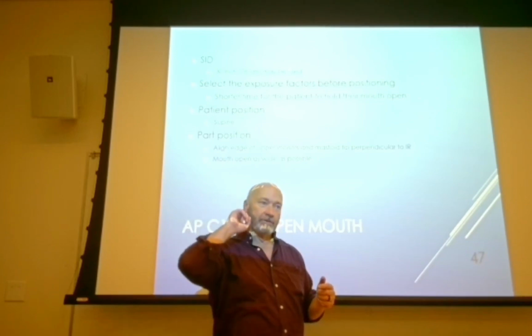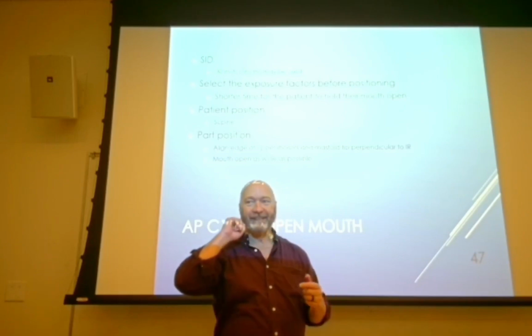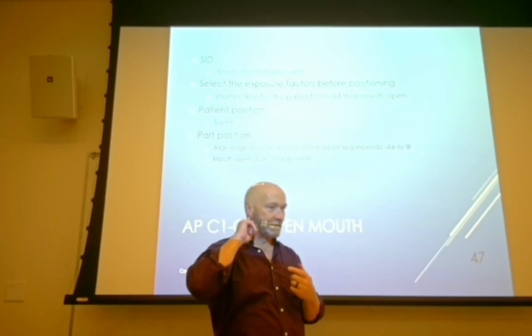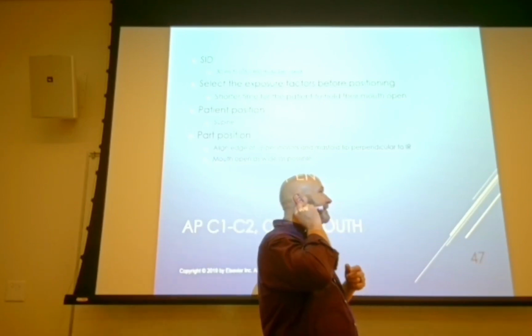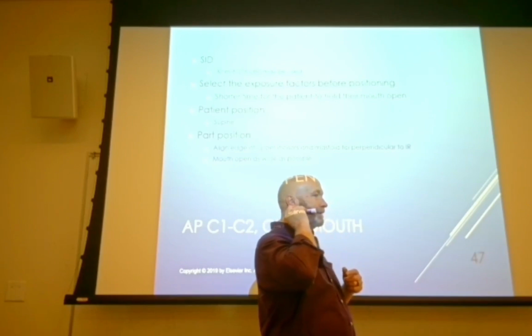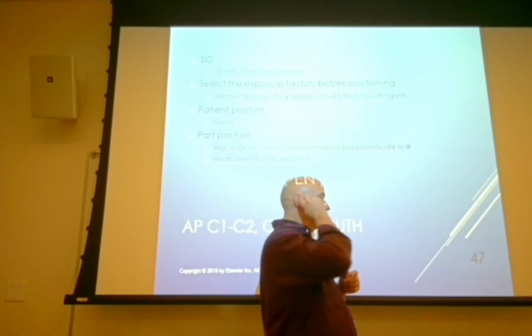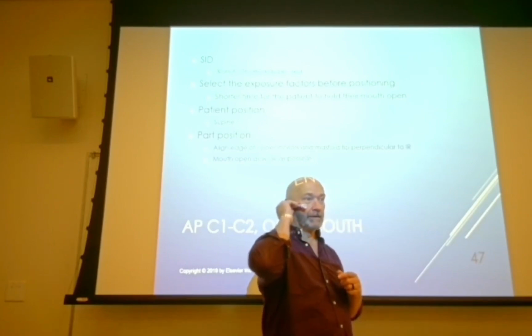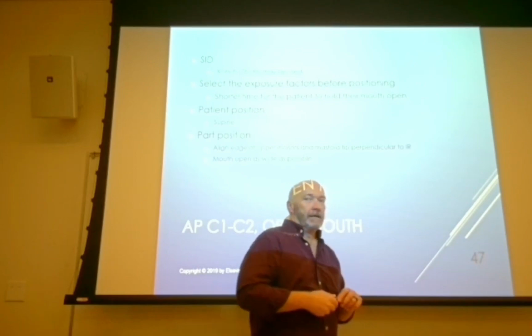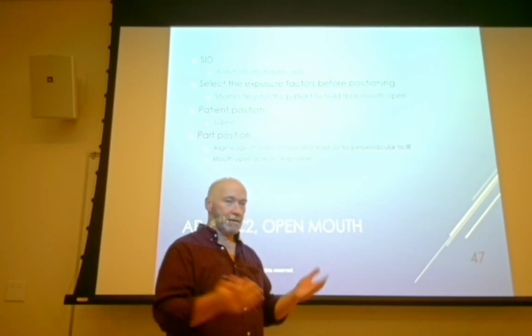So what you're going to have to do is find that, feel of that, and then have the patient show you their teeth, and then you're going to have to flex and extend for that. Now, that is my occlusal plane. That's my EAM, or my acanthomeatal line. They're pretty much parallel to each other? Yeah. So now let's go back to the patient who's on a backboard in a collar.